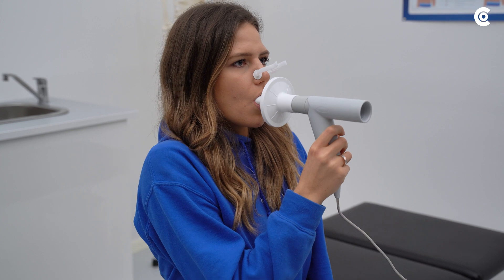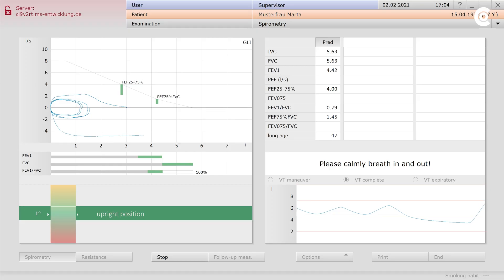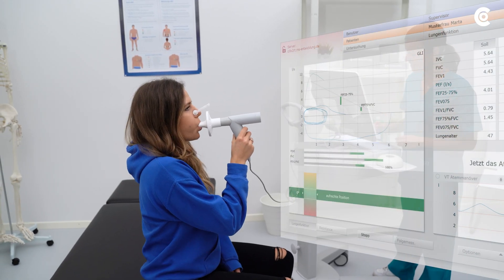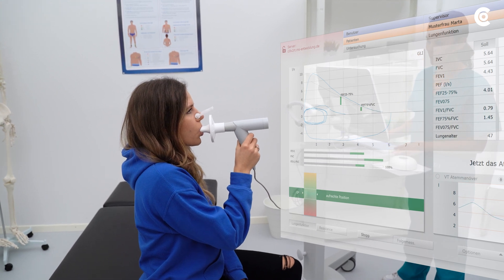If the patient sets off well with the breathing maneuver but stops too early, there will not be a cohesive curve. Therefore, make sure that the patient completes the entire breathing process properly.